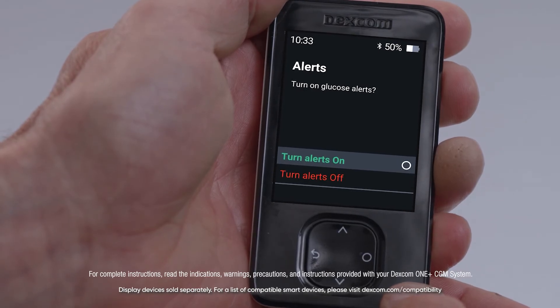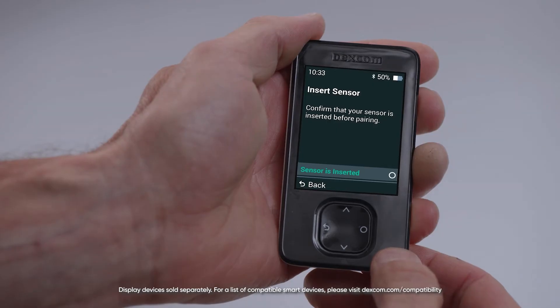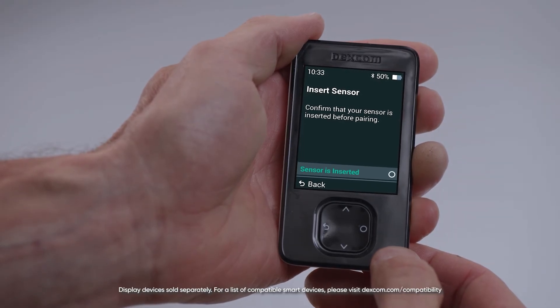Remember, you can always turn your alerts on or off or adjust them later under Menu, Settings, Alerts. After learning about your system and choosing your alert setting, it is time to insert your sensor. You will see the Insert Sensor screen at this point. For printed instructions on how to insert your sensor, see the instructions in your sensor box.